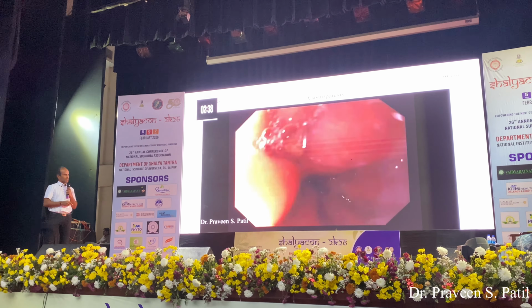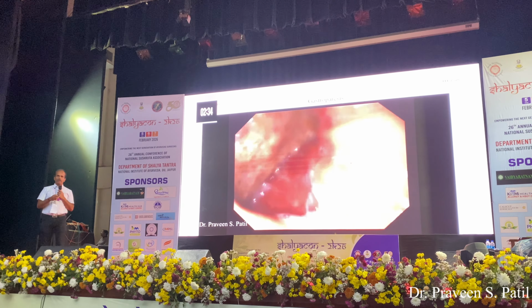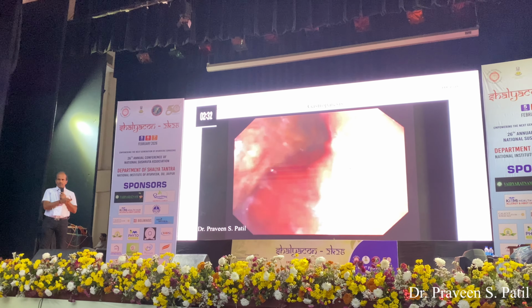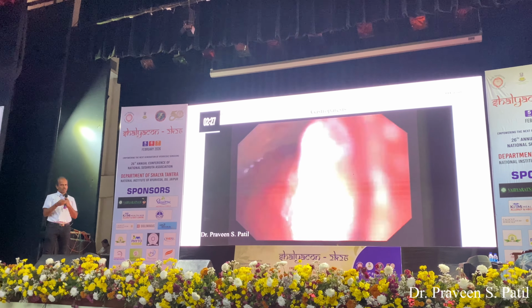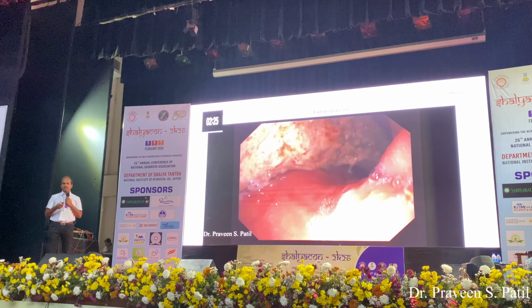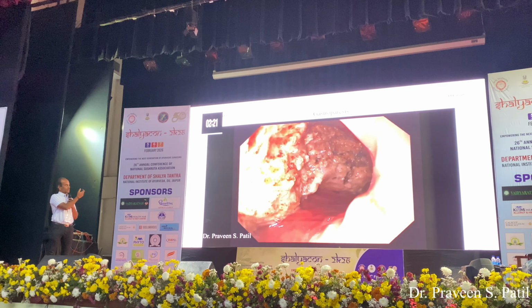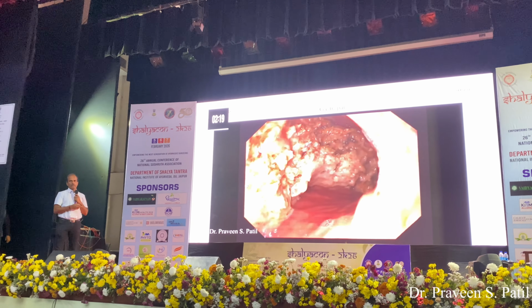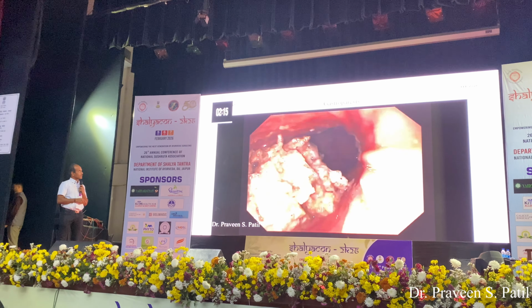So this is a case of gastroparesis. See, this patient has Hrutkanta Daha only, but in a long standing diabetic patient, diabetic neuropathy causes disproportion in the pyloric constriction and relaxation, and after 12 hours of fasting, we can see the food in the corpus of the stomach.